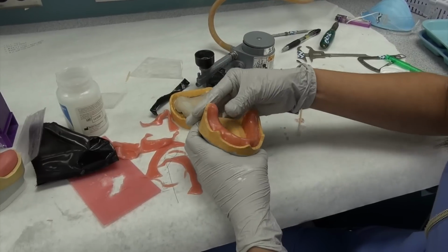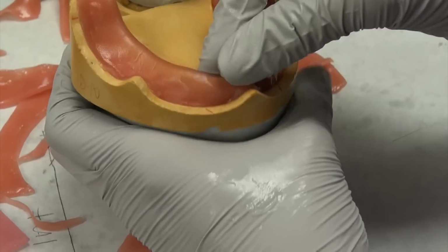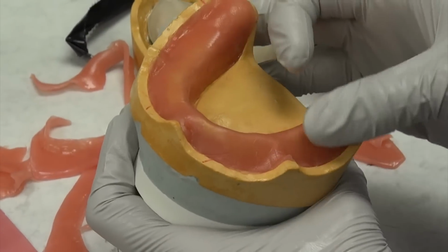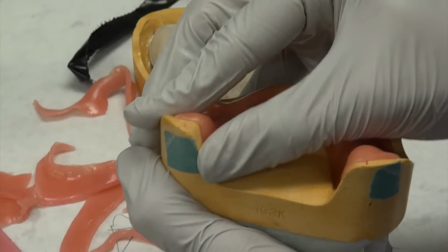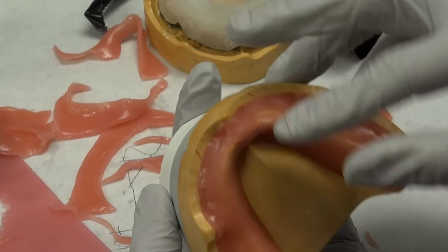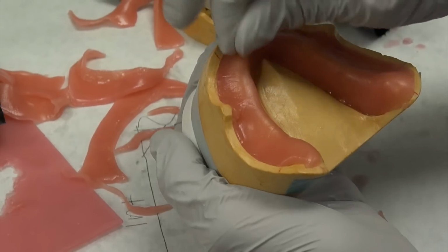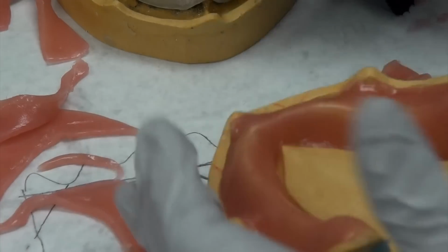Now again, just as we did before, to thin out that crest and fill, see how you start seeing that translucent color? Okay, so as it has thinned up, and once you are satisfied with how it has essentially been filled up. You don't want it to be too yellow. See how it's super, super yellow right there? This is a perfect example. Versus about right here. That means it's getting a little too thin. See how I'm pinching it? And it went away? Again, right here, just going to pinch it slightly. It's all about manipulation of the triad material.